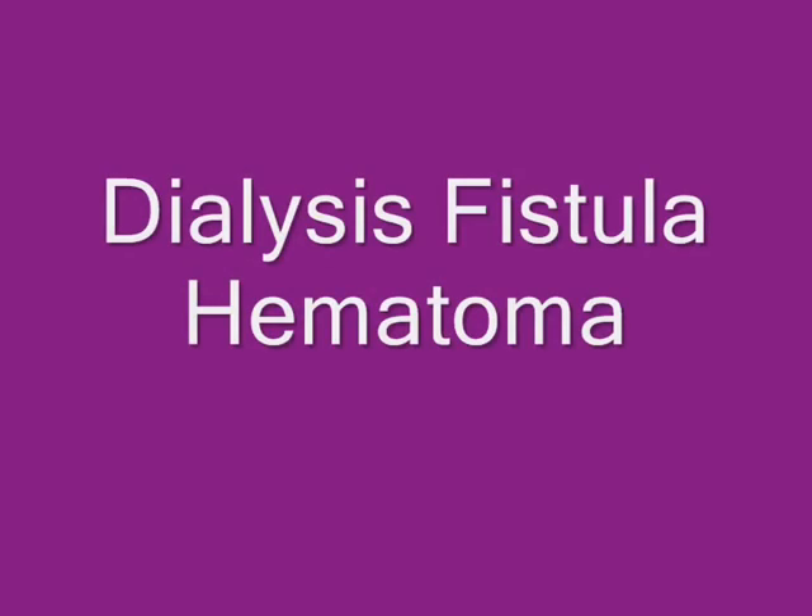In this video, the ultrasonographic appearance of a dialysis fistula hematoma will be shown.